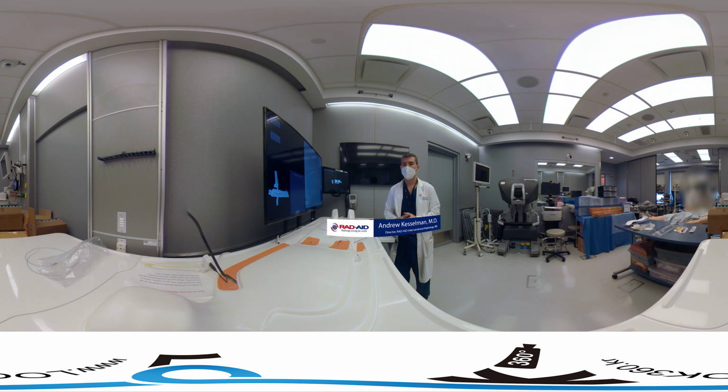So for this module, we're going to be doing a basic transarterial chemoembolization procedure, or a TACE. This procedure is designed to treat HCC, or hepatocellular carcinoma, in the liver. What we're going to be using is the same diagnostic tools we did before, here on the Mentis simulator again. Alright, so let's get started.